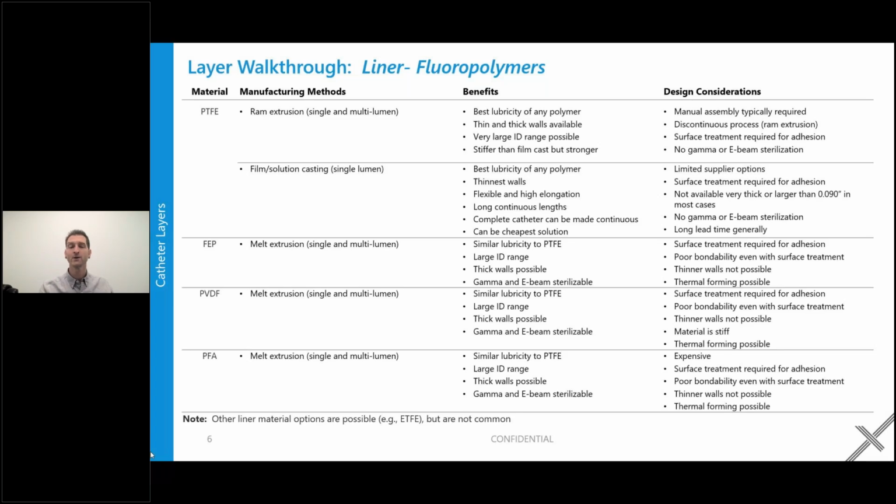The more strain that you're putting on that, the more likely it is for that to fail. So that's why we don't see them used very often. They get used in special cases. People are trying to use them more frequently, but it's difficult. And so again, PTFE is the gold standard for the most part.